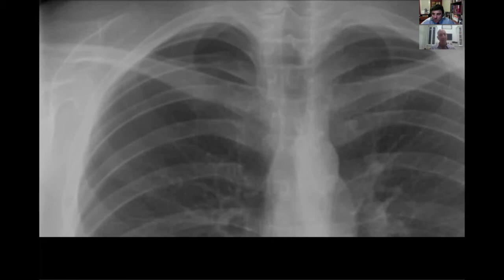And in addition, the other thing that's really, really important, almost just as important, is to have a really large monitor. I see people trying to read these on laptops or tablets and other types of small screens. It's brutal. You really need at least a good 27 inches at a minimum of a monitor in portrait mode with 4K. There's a lot of other things that are important. For example, the ambient light in the room, when you're in your reading space, it needs to be dark and the windows need to be closed. You have to have the ambient light down, because that again will really impact the contrast of the shadows that you're seeing.